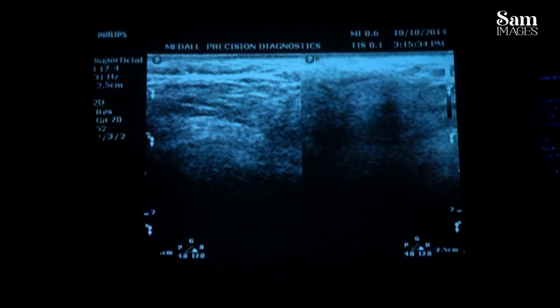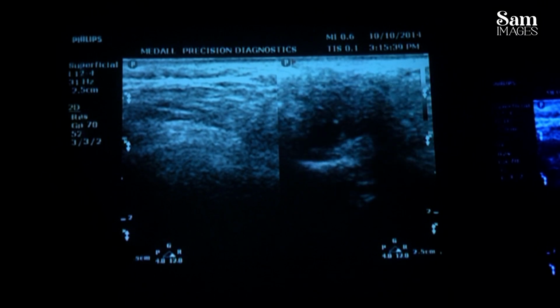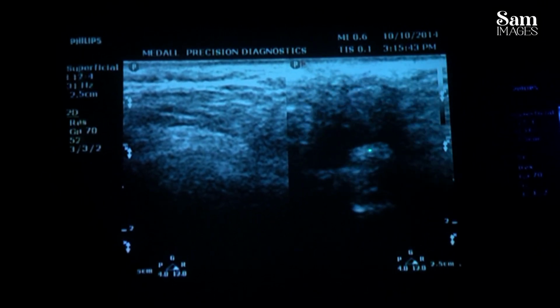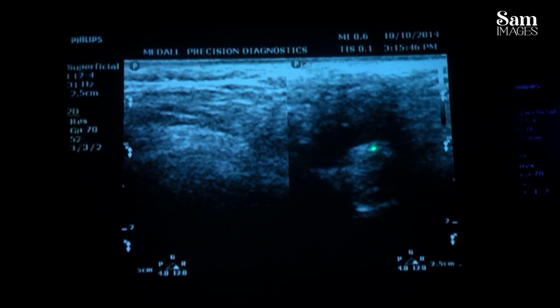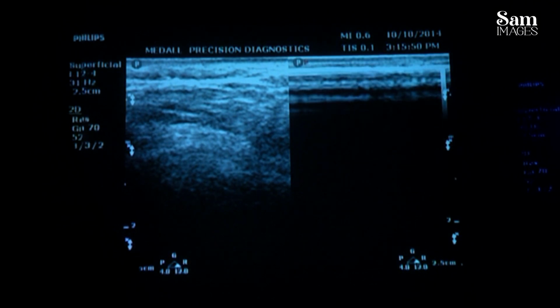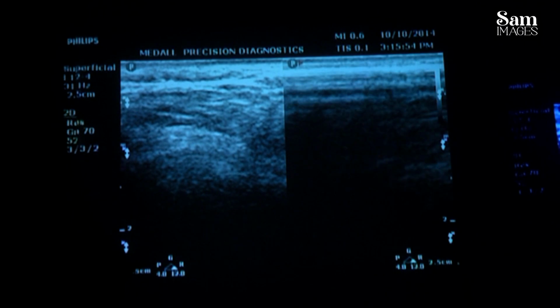See, sometimes what will happen, because of the gel, it will slip from there when he is doing it. This is, see, it is not opening at all, it is not slipping out of that fossa at all. So that is typical of a bony ankylosis. Okay, understood? Right, fine. Thanks.